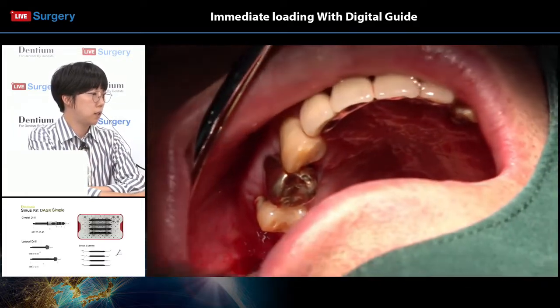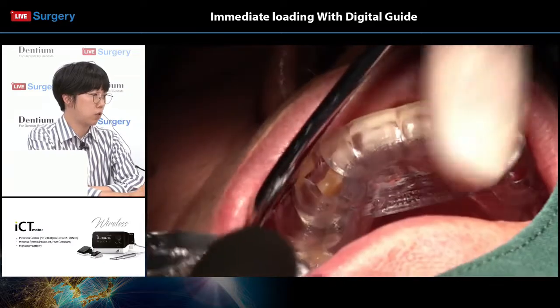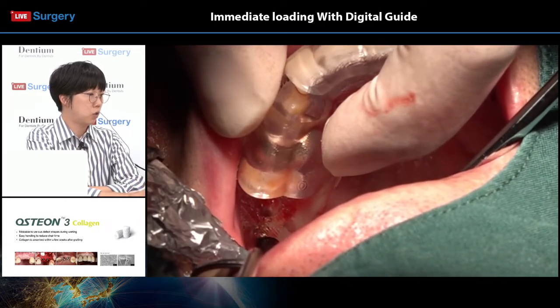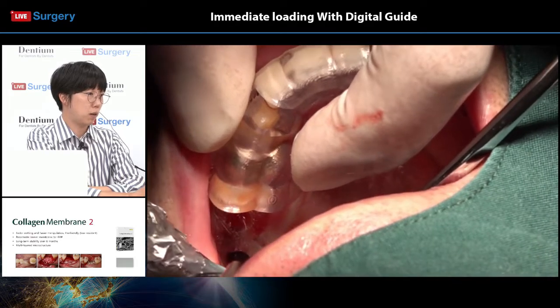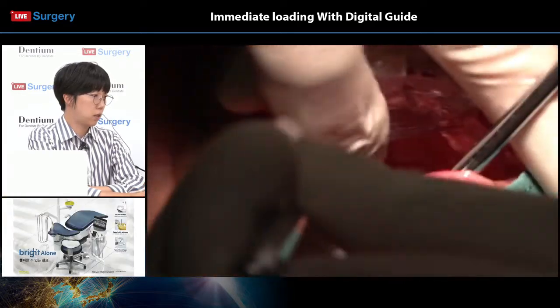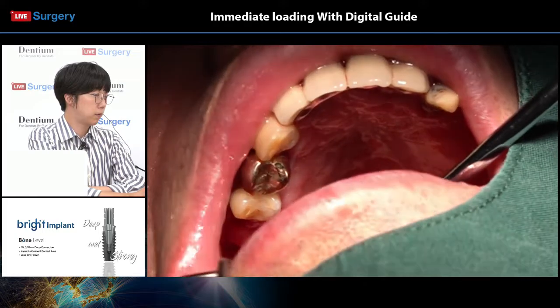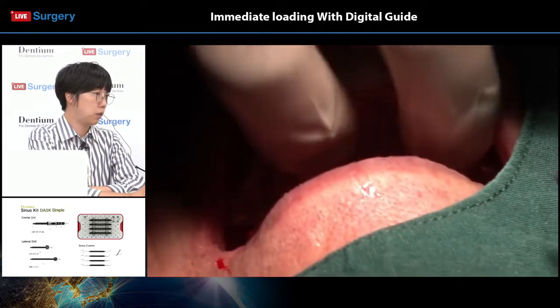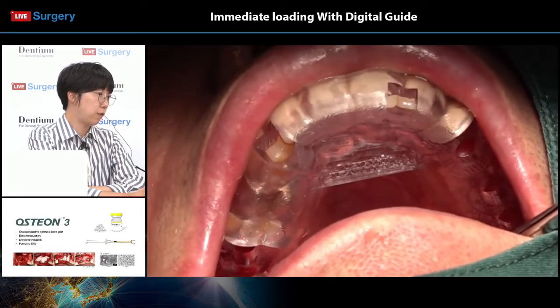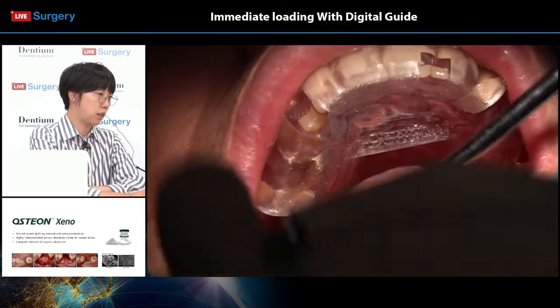So in most cases, the holes of the stent and the surrounding gingival status should always be double checked before actually going into the surgery. If the holes are deviated to one side or if the tissue around the implants are unfavorable, changes can be made in reference to the prepared guide. Dr. Lee has probably under-drilled the number 17 area, not in full depth, to do the bone graft, using the osteotome and doing the sinus lift firsthand.